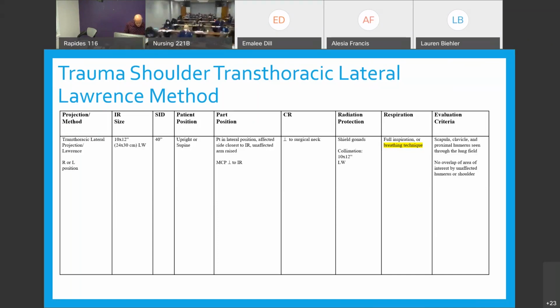It says, although this projection can be carried out with the patient in the upright or supine, the upright position is much easier on a trauma patient. You hear that a lot with all of your upper extremity. We can do all upper extremity on table. But if you come in and you're crushed up, your arm's all crushed up, you're protecting it, am I going to ask you to lay on a table? Or is it going to be easier for me to stand up?